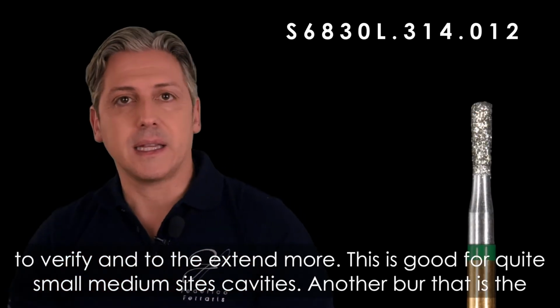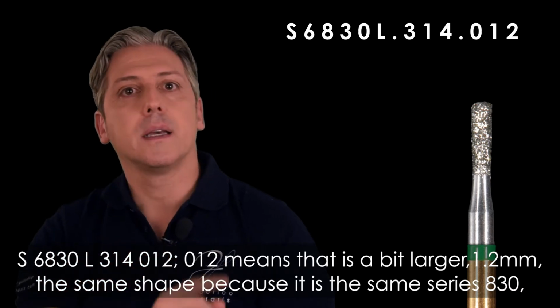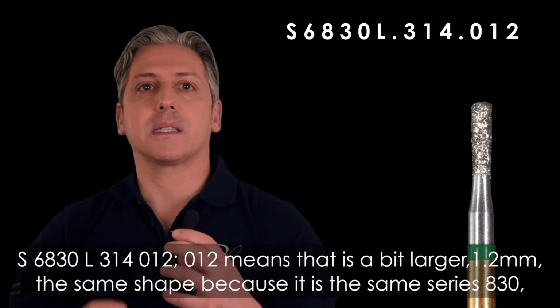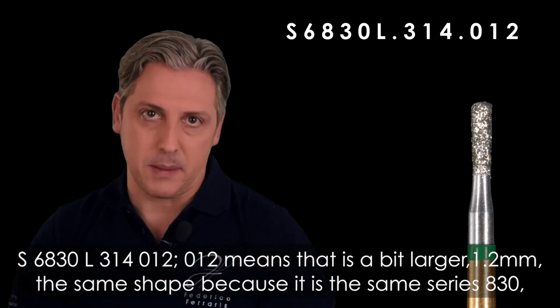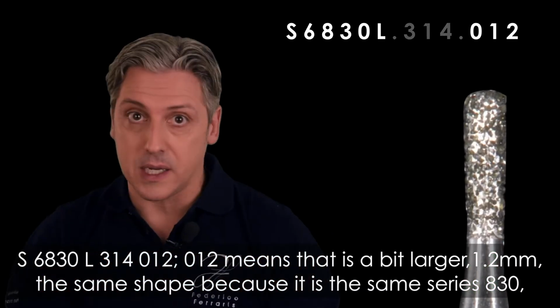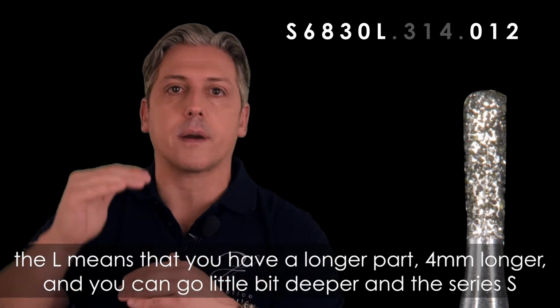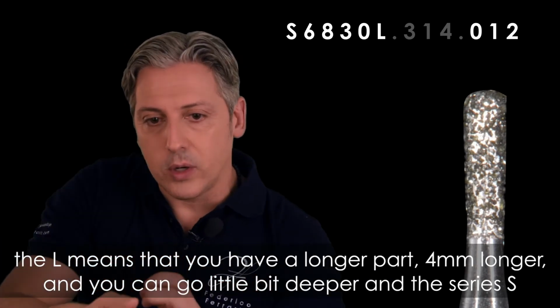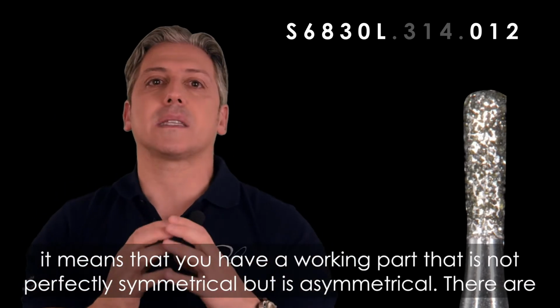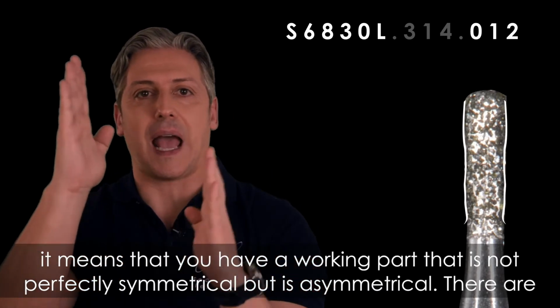Another burr is the S6830L314012. 012 means that it's a bit larger, 1.2 millimeters. The same shape because the same series, 830. The L means that you have a longer part, 4 millimeter longer, and you can go a little bit deeper. And the series S means that you have a working part that is not perfectly symmetric, but is asymmetric.